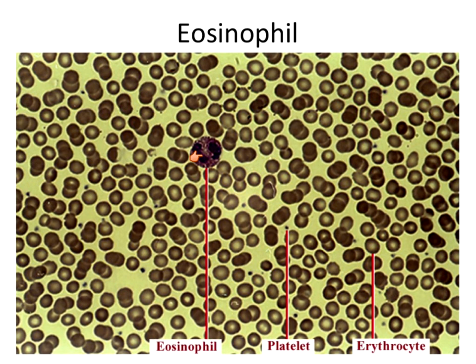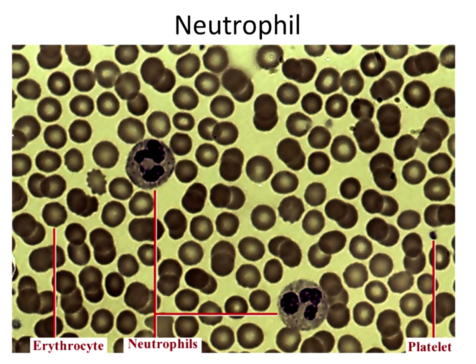Going back to the eosinophil — notice the nuclei have just a little bridge connecting the two lobes. Neutrophils have a trilobed nucleus with one, two, three lobes. This is also a granulocyte. So eosinophils, neutrophils, and basophils are all granulocytes, while monocytes and lymphocytes are agranulocytes — they don't have those granules.